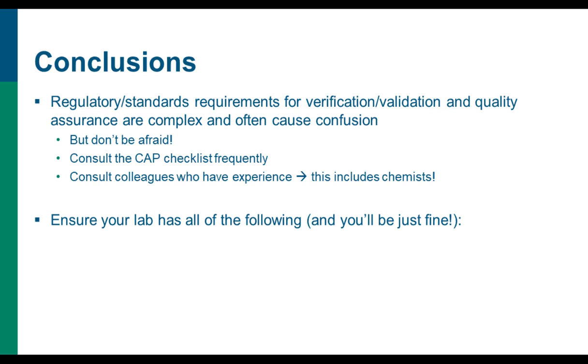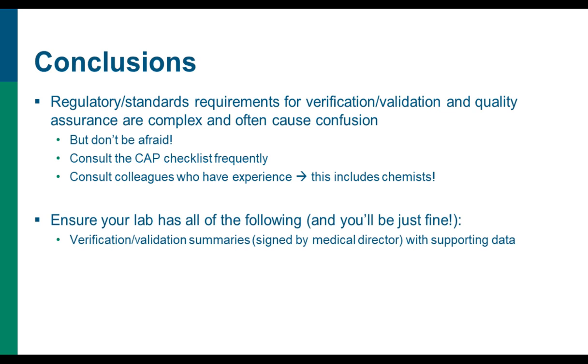If you make sure that your lab has all of the following, you will be just fine and not have to worry about it. So even though it's complex, there's a few things that you'll need. You'll want to have your verification and validation summaries signed by the medical director with supporting data, and make sure you keep those for at least 2 years after the assay is finished or not being used. You want to make sure you have test procedures for all of your specific assays that you're running.